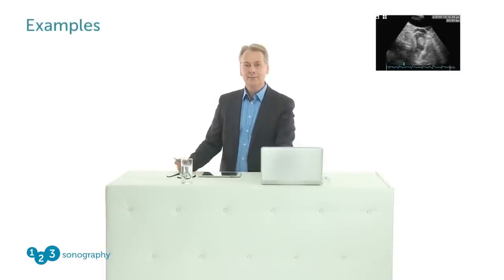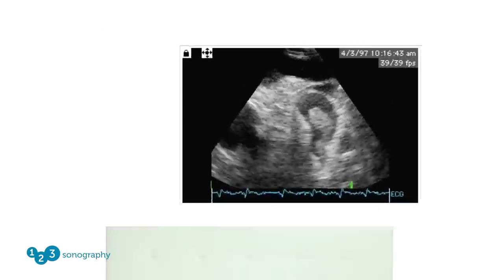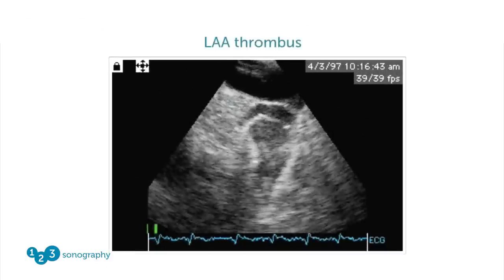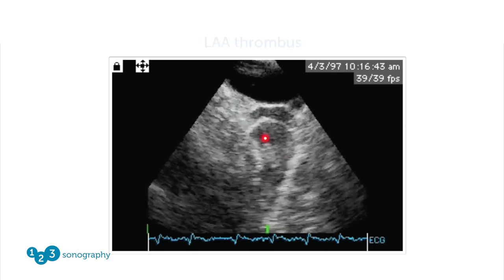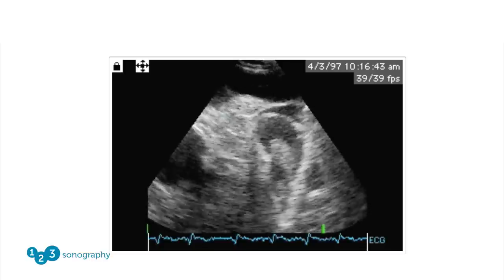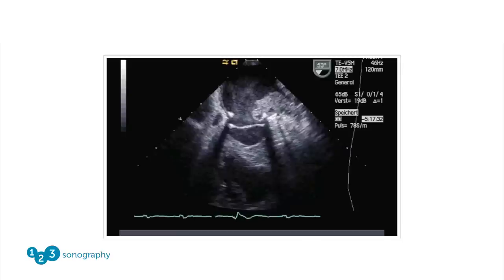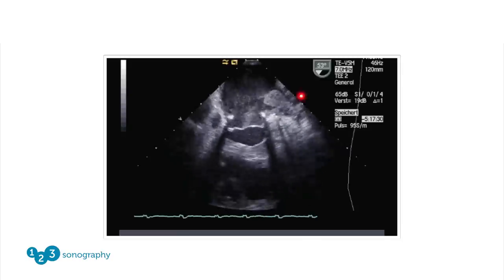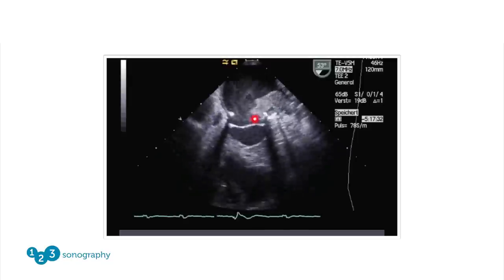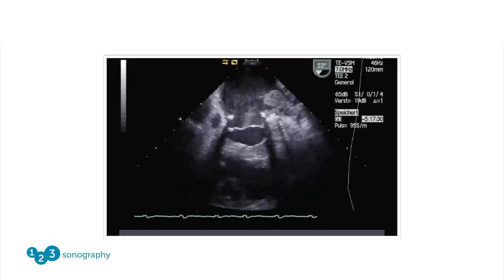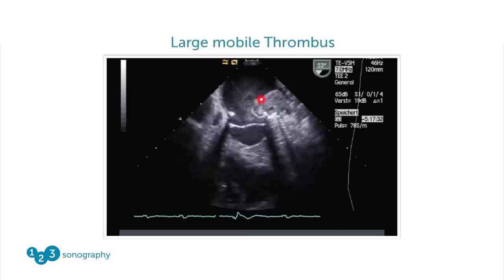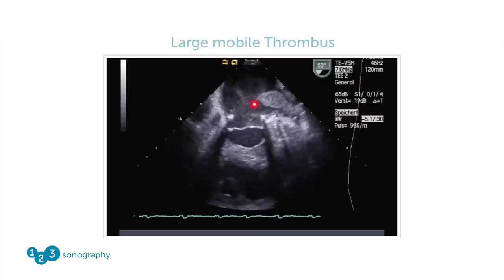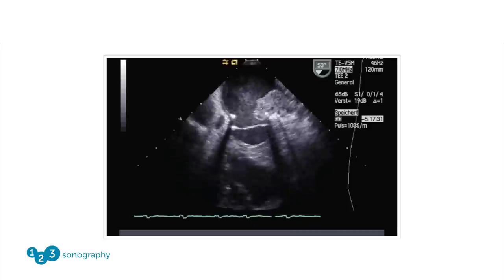Let's take a look at some examples that highlight the advantages of TEE. What we have here is the left atrial appendage, and right inside it we have a thrombus. You cannot see this from a transthoracic approach. This large thrombus is peeking out of the left atrial appendage — probably a high risk of embolization.